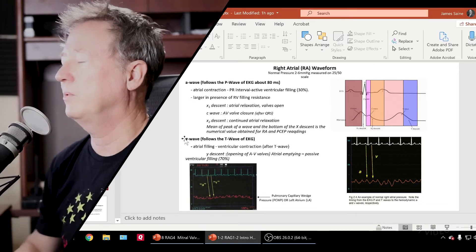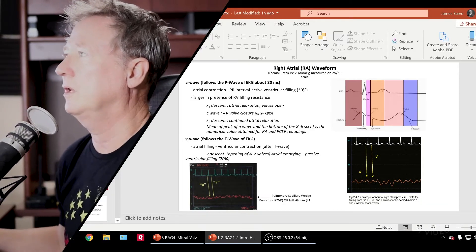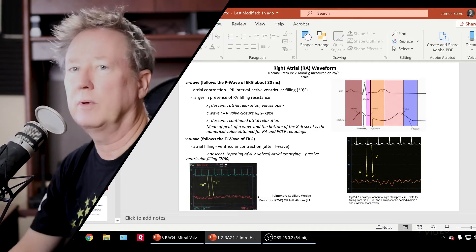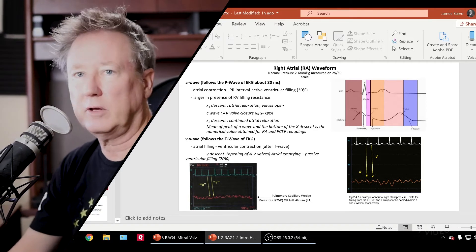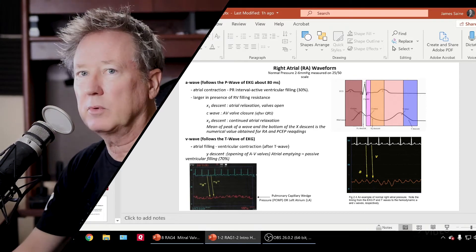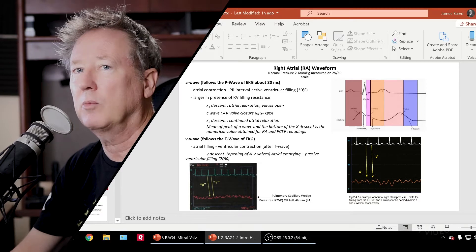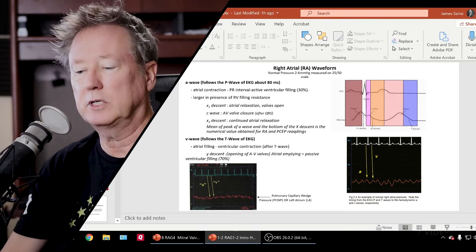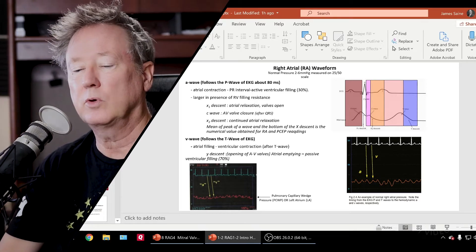Here is an example of a right atrial waveform. There are similar characteristics between a right atrial waveform, a left atrial waveform, and a pulmonary capillary wedge pressure.